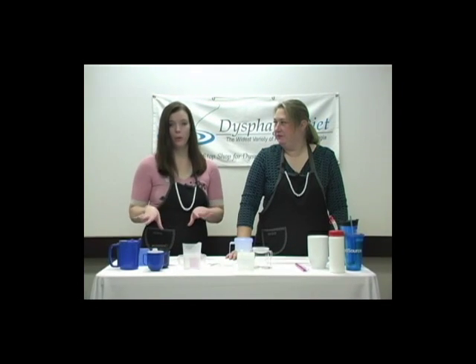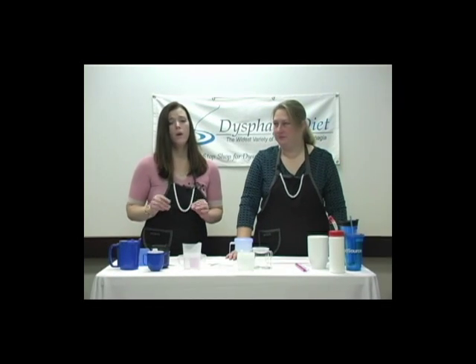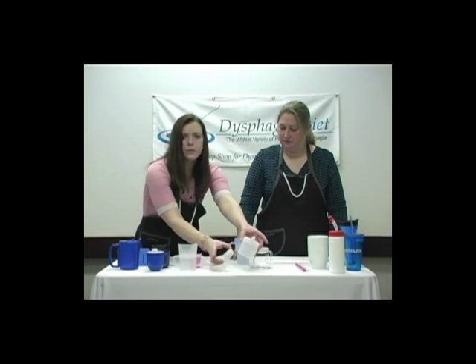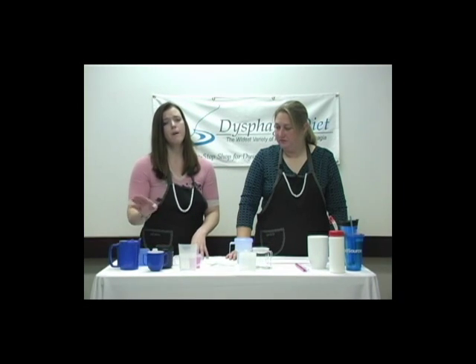Okay, moving on to drinkware. Now this is an area where you're probably going to want the advice of your medical health professional because there are just so many options available. You've got different types of handles, interchangeable lids with some of them, weighted bases, and flow controls. So it might be best to seek their advice before choosing a style.